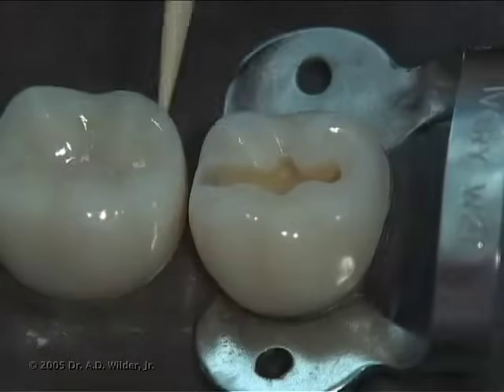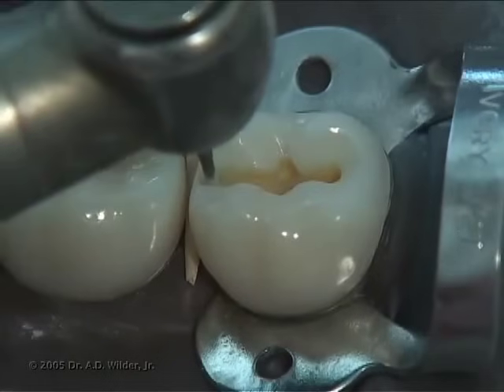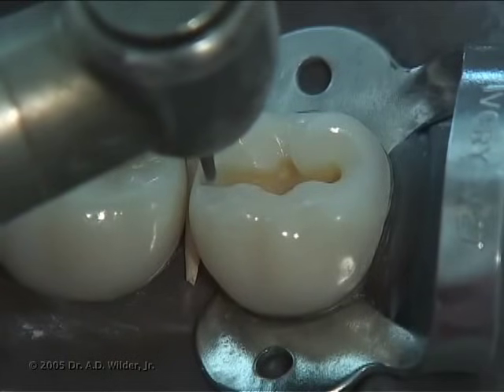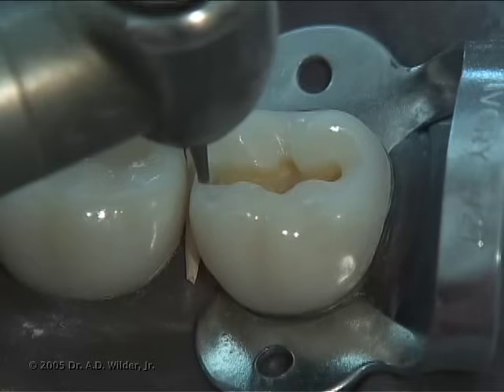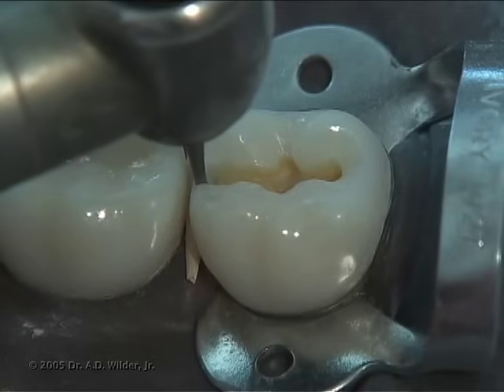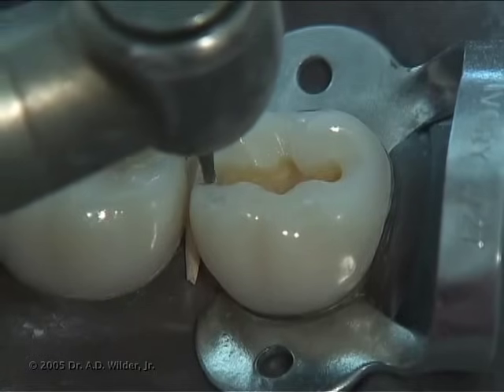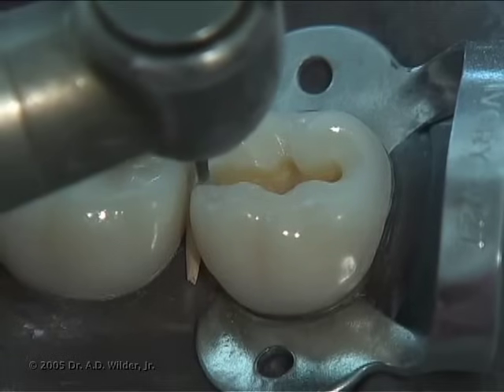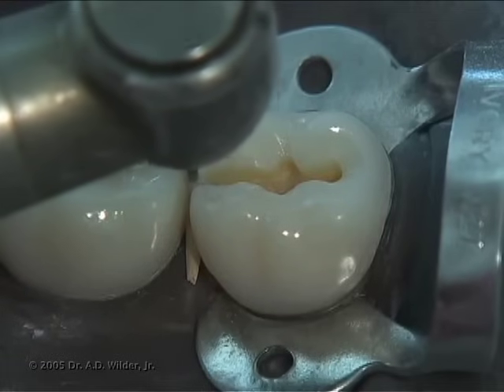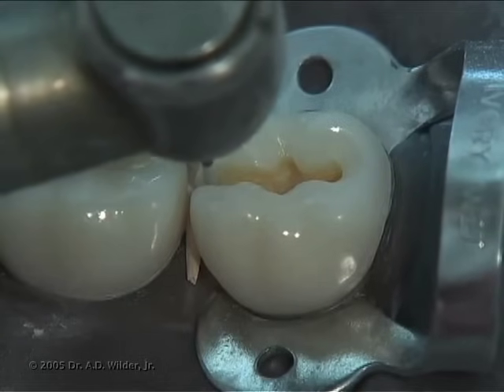Place a wedge under the proximal contact prior to preparing the proximal box, which has several advantages. It moves the teeth slightly apart to increase proximal clearance and decrease the likelihood that you nick the adjacent tooth. Center the burr over the dentin enamel junction and make a ditch cut along the DEJ, moving back and forth while extending gingivally. Gradually and carefully move the burr toward the adjacent tooth until you break through the enamel shelf. You should see the burr start to poke through as the remaining proximal enamel gets thinner and thinner.